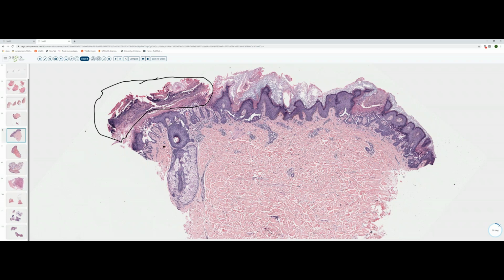You can rarely see FAD in an epidermal nevus. Those patients are probably mosaic for Darier's disease. And then finally, you can see FAD, this change, as just an incidental pattern, just a small little focus, either in an excisional biopsy of a basal cell carcinoma or in a variety of inflammatory and neoplastic conditions.